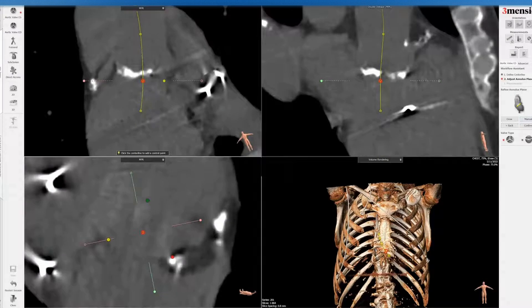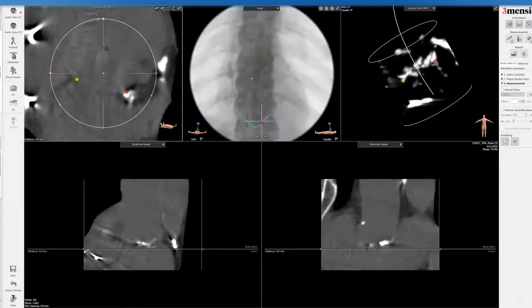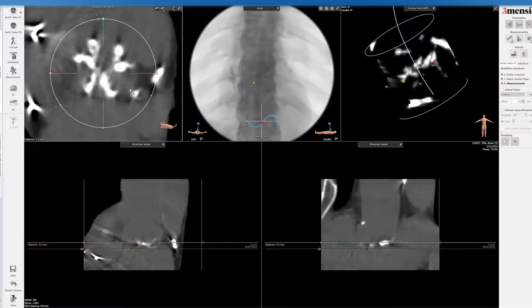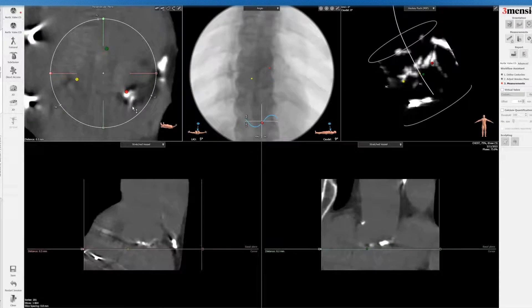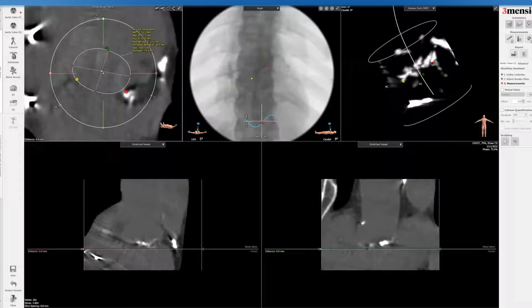If I believe this is the right estimate, you can see it's going to be very hard to trace out the perimeter. But what you can do is just do an estimate and see how it delineates. You can also look at how the root starts to emerge because the annulus is right at the base of that. Again, this is an estimate, not exact. You can see a perimeter of 75.4 and an area of 434.